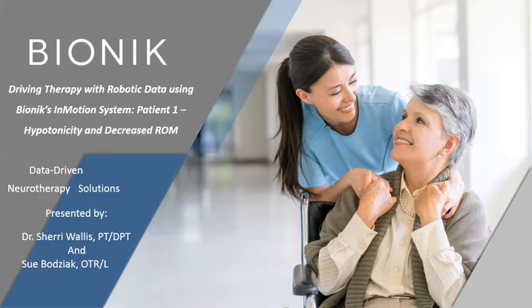During this session, I would like to introduce you to the InMotion Reporting System, beginning with the InMotion EVAL, and then talking about types of treatment protocols that can be used to address specific deficits using a patient example. We will follow that with a discussion with Sue Bodziak from Tallahassee Memorial in Tallahassee, Florida, who will lead us through how she utilizes the reporting capabilities of the system to drive therapy within her facility.